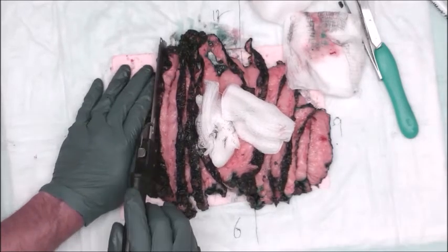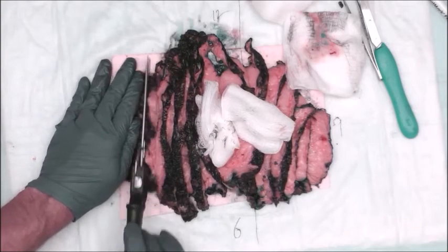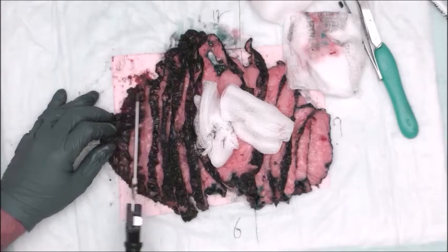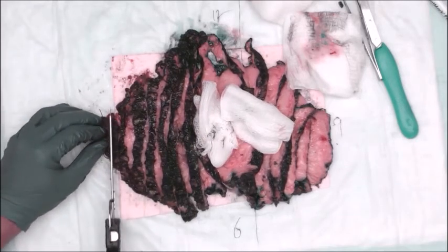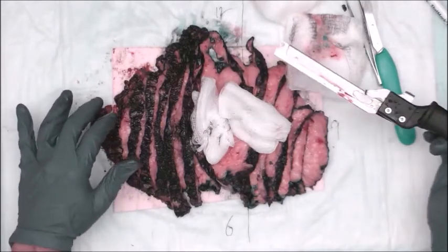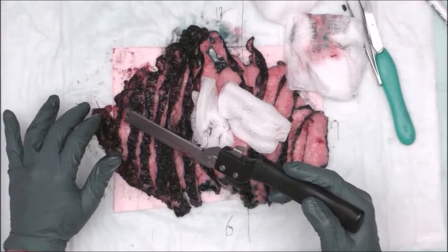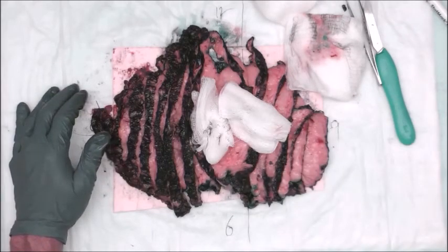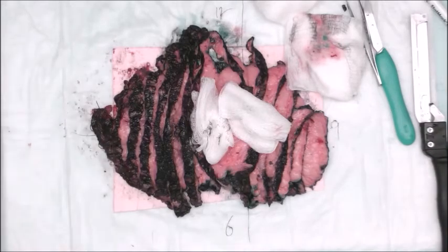Continue sectioning. Now, as I go to the lateral aspect, I'm going to end up sectioning and palpating this lateral aspect a lot more at the very end to make sure there's not any lymph nodes here. All right. Let's pause for a second.